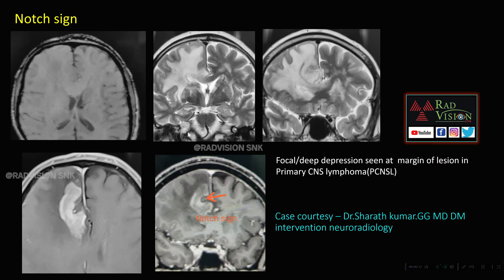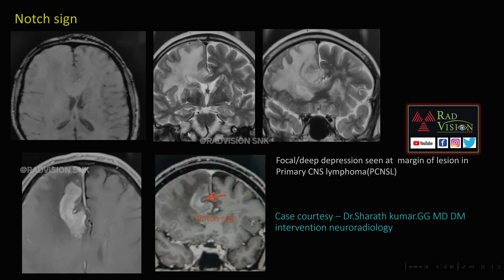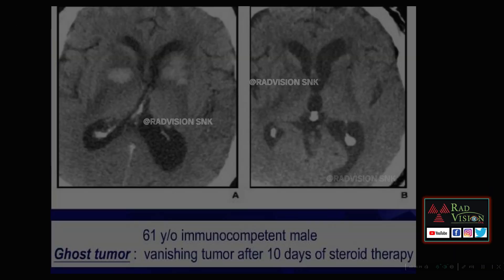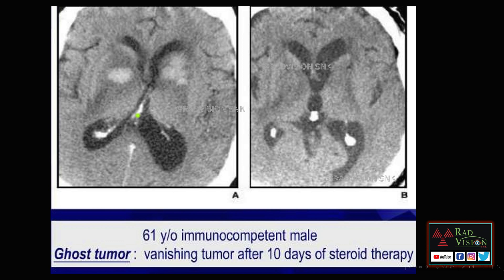It is called a ghost tumor because these hyperdense lesions in the bilateral capsulo-ganglionic region, after steroid therapy for 10 days, completely disappear — hence called a vanishing tumor or ghost tumor. This is characteristic of CNS lymphoma.